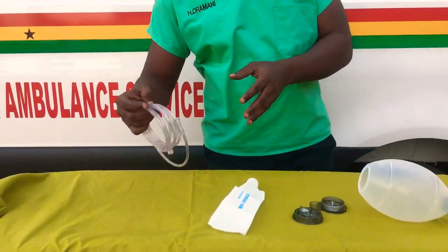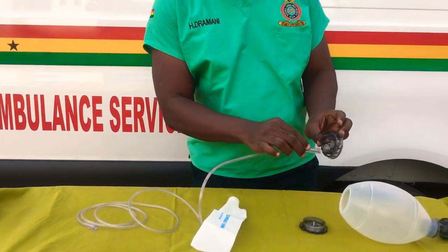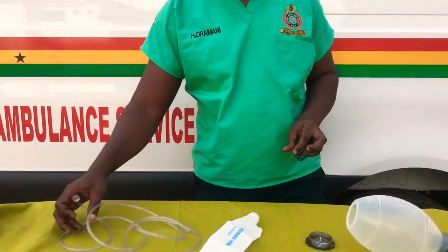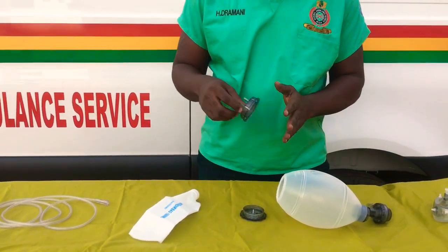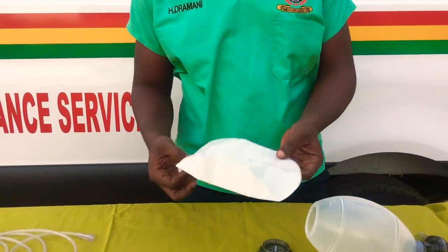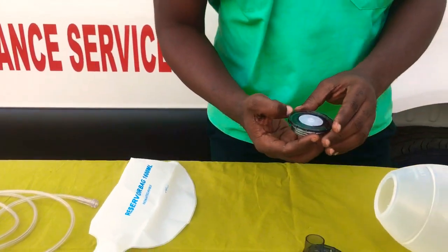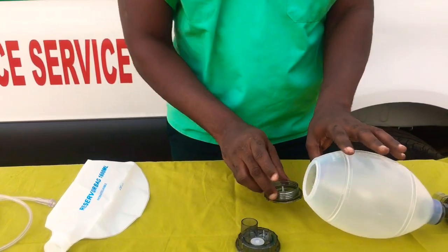First, we look at the oxygen connecting tube. One part of it is connected to this part, and then the other part will be connected to the oxygen port in the AMBU or any oxygen cylinder. Now, this is what we call the reservoir. Then, this is what we call the oxygen air inlet valve, and we'll see how to fix it.